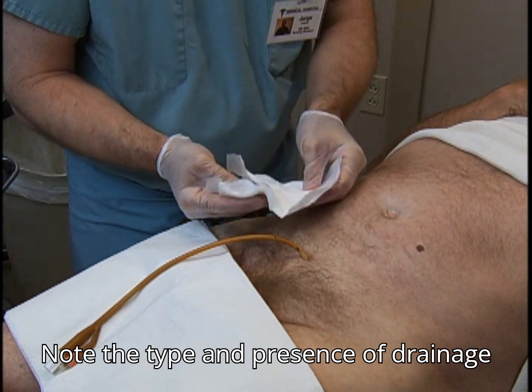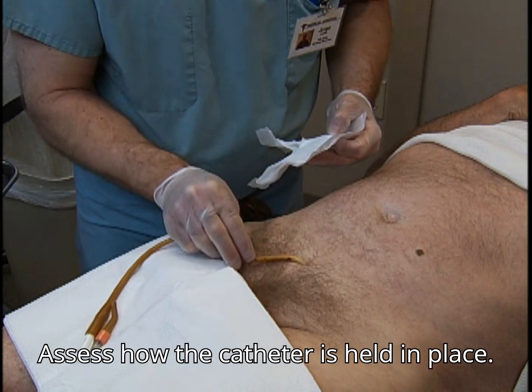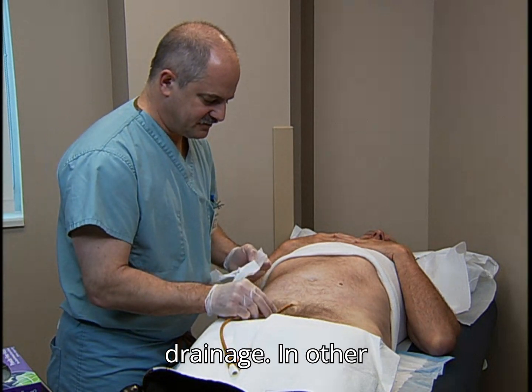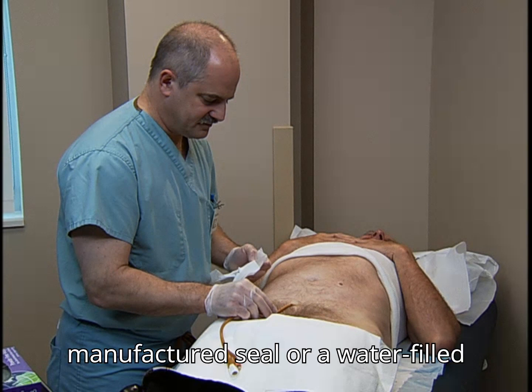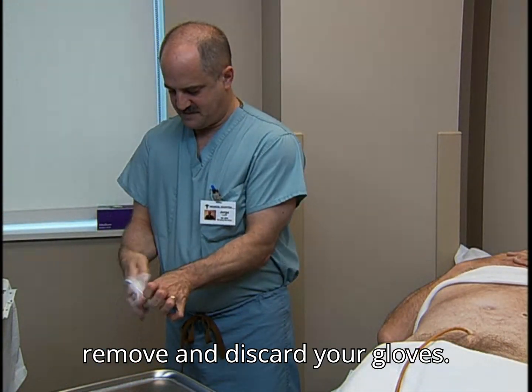Note the type and presence of drainage and check for signs of inflammation. Assess how the catheter is held in place. If sutured, look for redness or drainage. In other cases, it may be retained by a manufactured seal or a water-filled balloon, much like an indwelling catheter as seen with this patient. Then remove and discard your gloves.